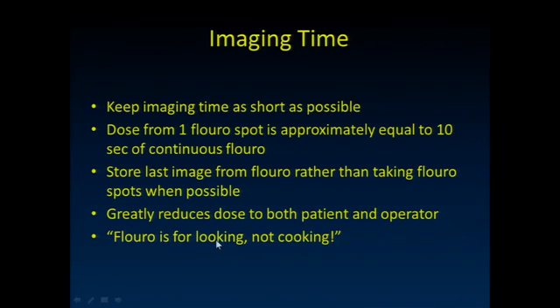I always say, right, fluoro is for looking, not cooking. If something's not changing, don't keep fluoroing, right? In today's systems where that last image hold stays up, if you're just not sure about something, but you need to look at an image for a little while to see what's going on, and it's not a dynamic thing, just get your foot off the pedal and look at that image and learn that. Getting your imaging time down will really be one of the best things that you can do in terms of keeping the dose as low as possible during fluoroscopy. And I think that's it.